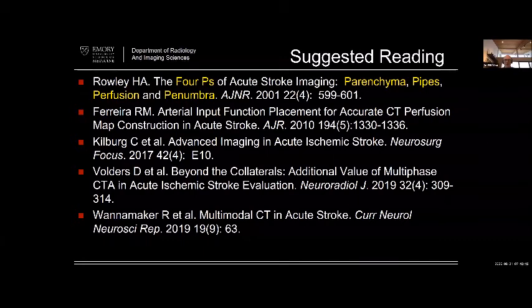Well, so when someone comes into the emergency room, Mark, at Emory and is hemiparetic, for instance, I presume they get a non-contrast CT scan. In that setting, unless they've had a witnessed seizure or something like that, do they all just go right to CTA? So do you have a stroke algorithm, essentially? Yeah, that's what we do.